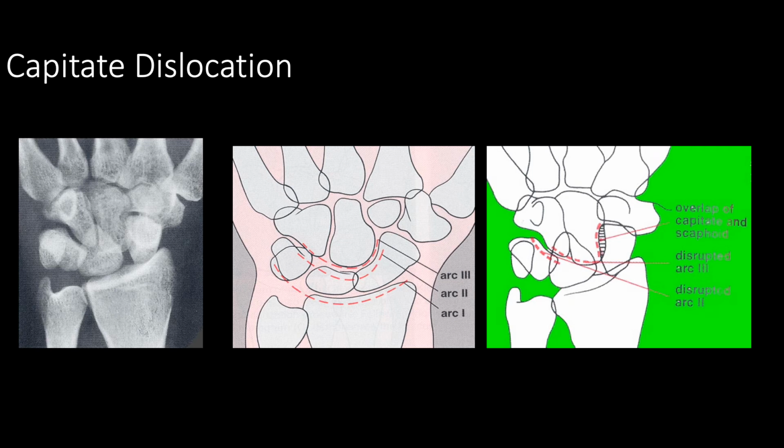So the main thing is to get used to looking at these arcs and make sure they're symmetrical and that they're not interrupted in any way.